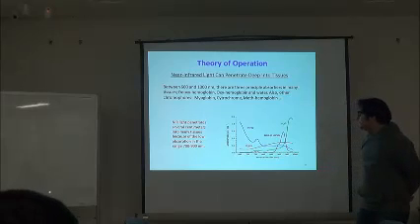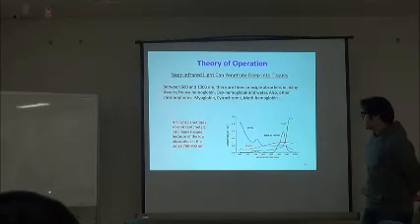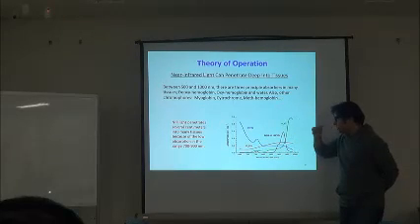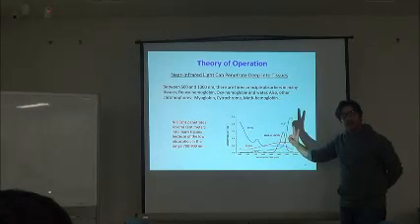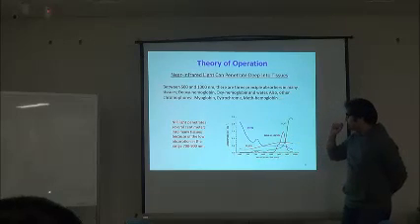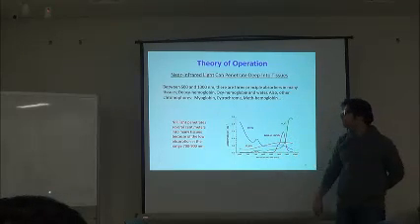Because you told us the H2O signal is not usually meaningful. Yes, that's right. To measure HbO and HbR, or we call it O2Hb or HHb, the oxygenated and deoxygenated hemoglobin, we need to have at least two wavelengths, because using the modified Beer-Lambert law, which I'll explain later, we will have a system of two equations and two unknowns.